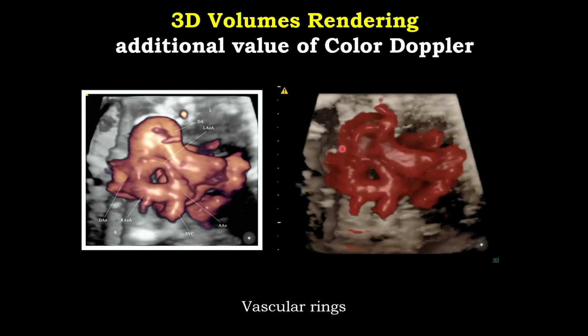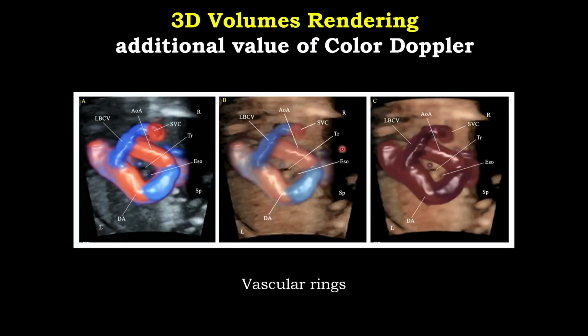But you know, the 3D imaging can give this opportunity and help you to see that spatial relationship. The same we can do when we look at the right-sided aortic arch, and the most common situation, then we have the right-sided arch to the left-sided ductus arteriosus.